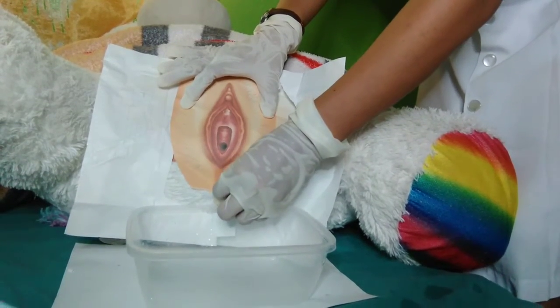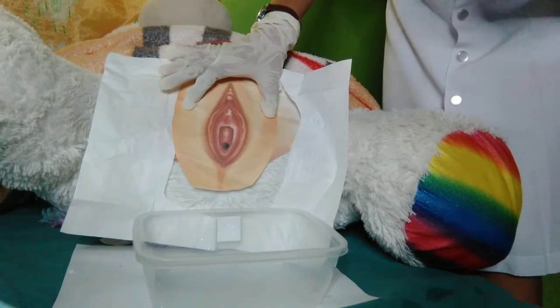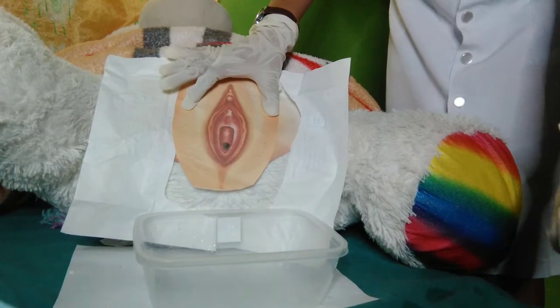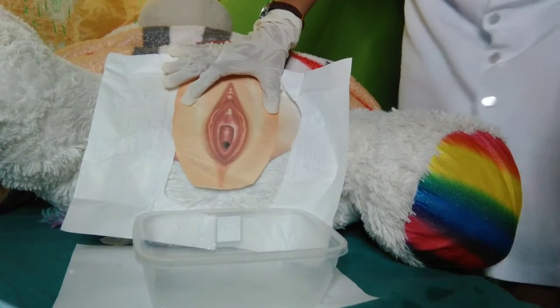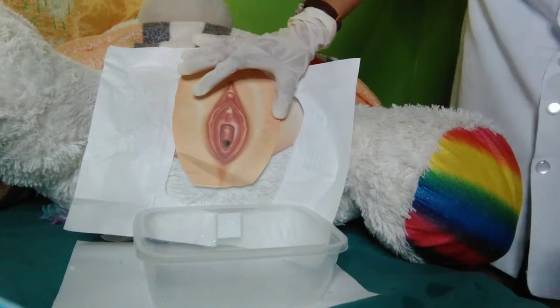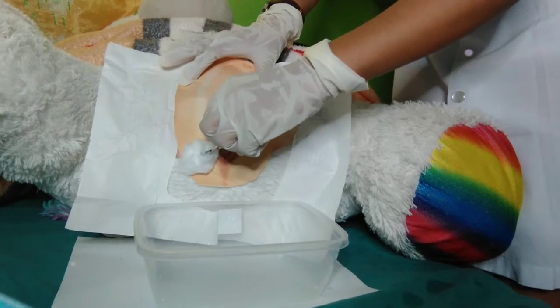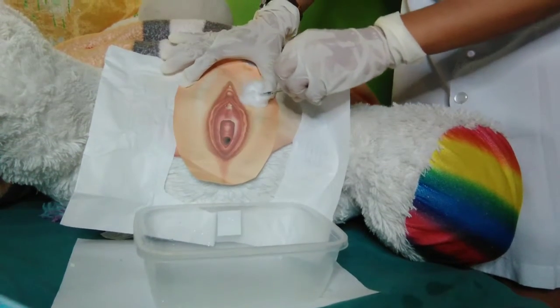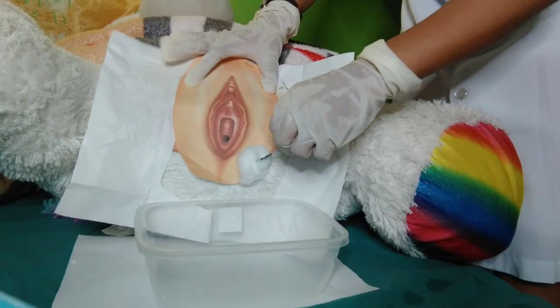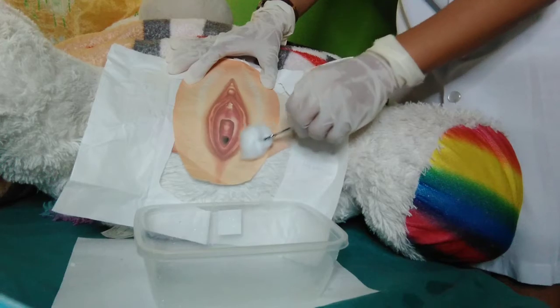So use a sterile forceps and a new cotton swab with each cleansing stroke. This step is to reduce the transmission of microorganisms while cleansing the perineal area.